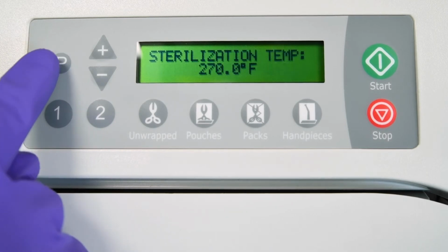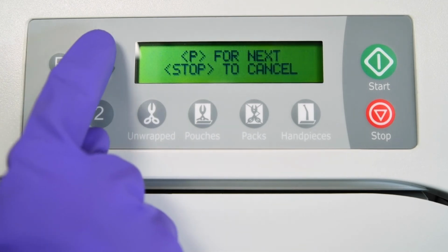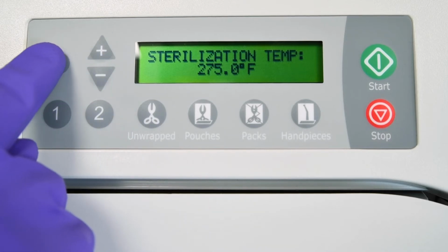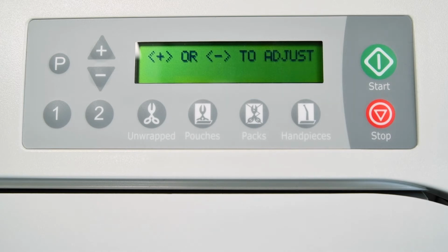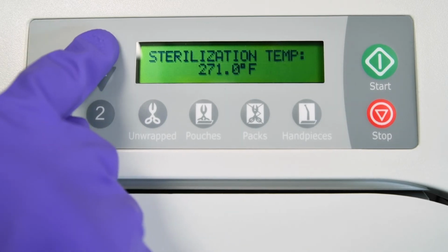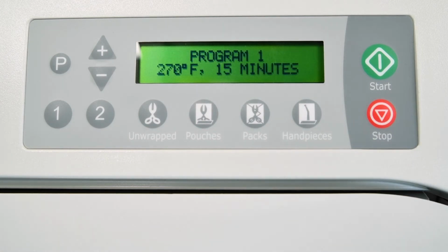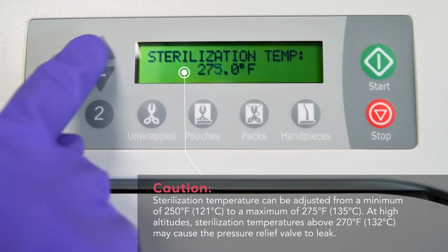The display will show sterilization temp and the current value. Press plus or minus to adjust the temperature in 1 degree increments. Once the desired temperature is reached, press P to set the temperature and continue to program the custom cycle. Otherwise, press stop to cancel the programming. Any temperature from 250 degrees Fahrenheit up to 275 degrees Fahrenheit can be selected.